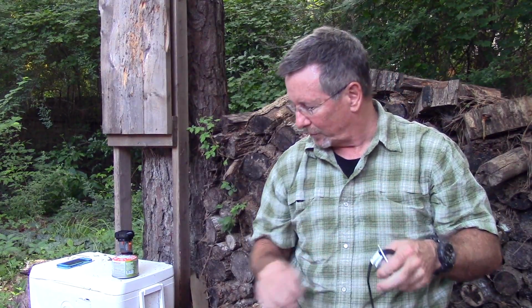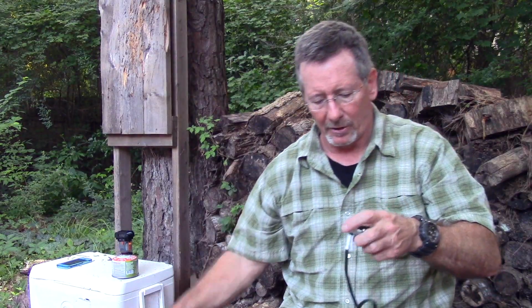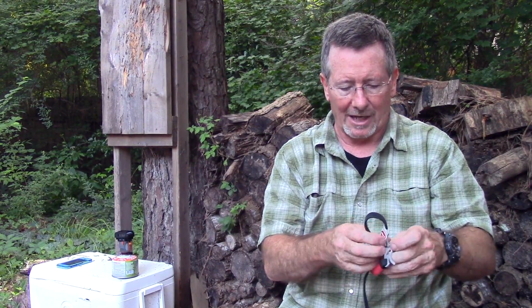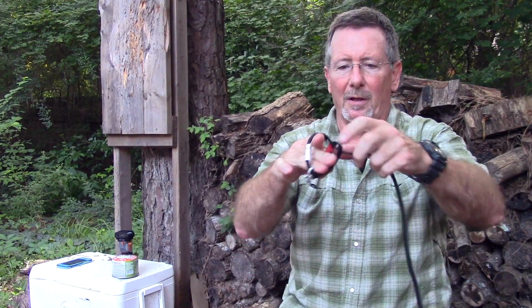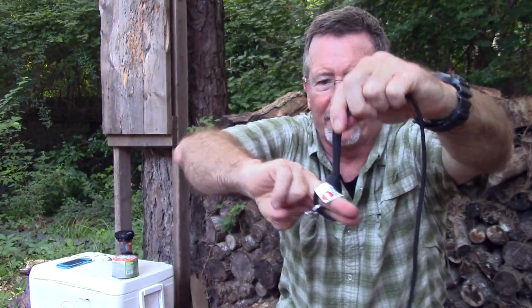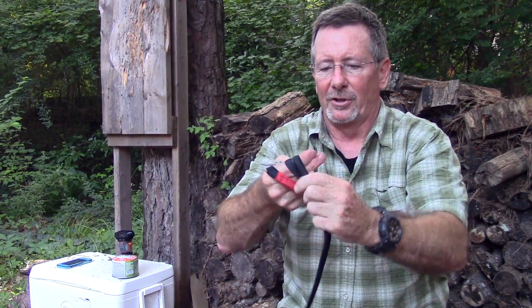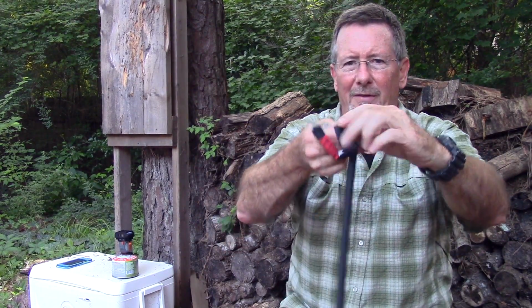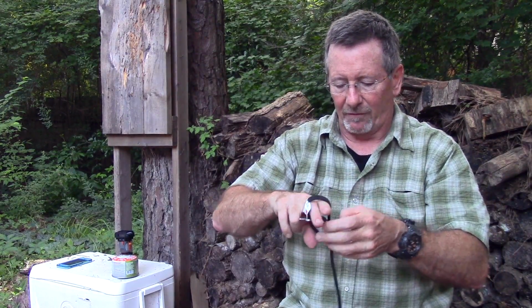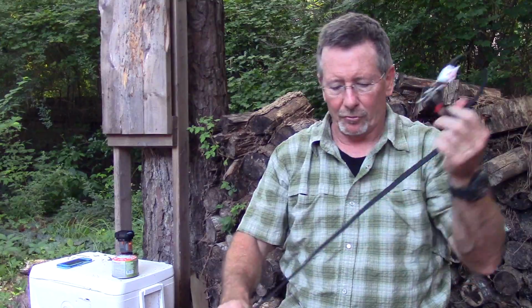Another thing I like about this one, even with the windlass one, there's a limit to how small it'll get. This one you could put on a really small child's limb, and it gets down as small as your fingers even. As you wrap it around, you get even tighter because it's so flexible. So I really like this one. This is a RATS tourniquet.